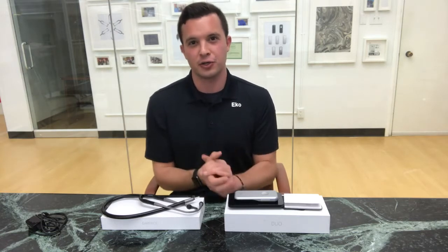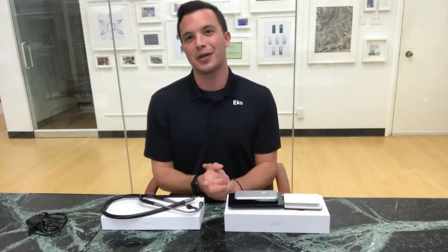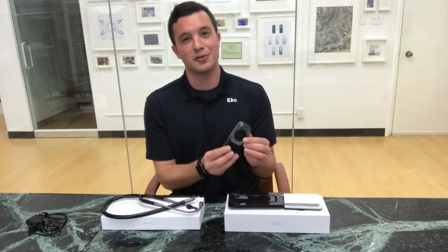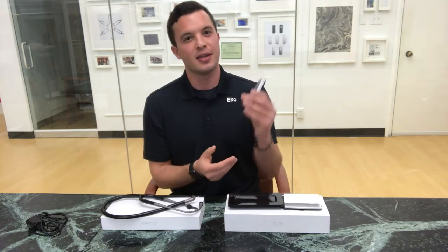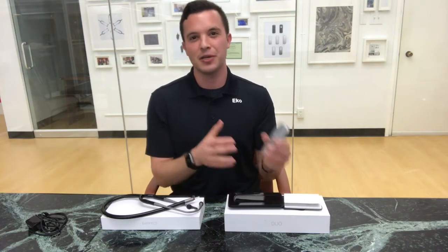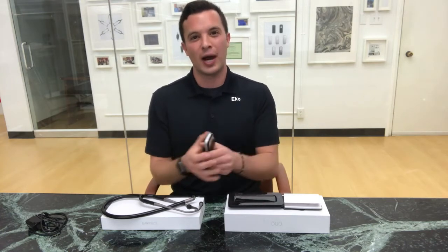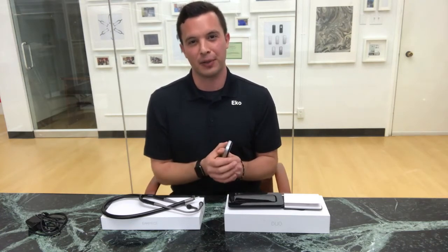Hi, I'm Jason. I'm one of the co-founders here at Eko and today I'm going to take you through how to get started with your new Eko DUO. The DUO is the first combined digital stethoscope and one lead ECG that fits in the palm of your hand, can be used by clinicians in the clinic or prescribed to patients at home, and pairs wirelessly with a compatible mobile application.